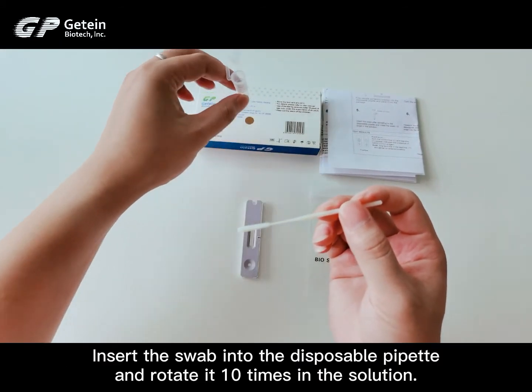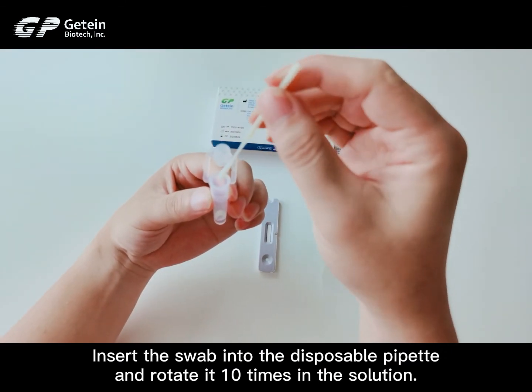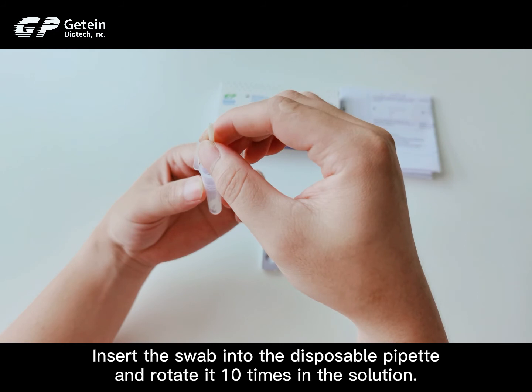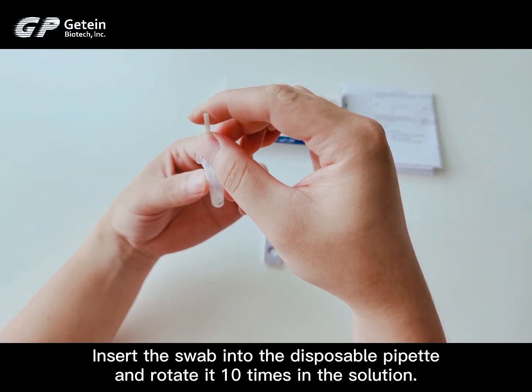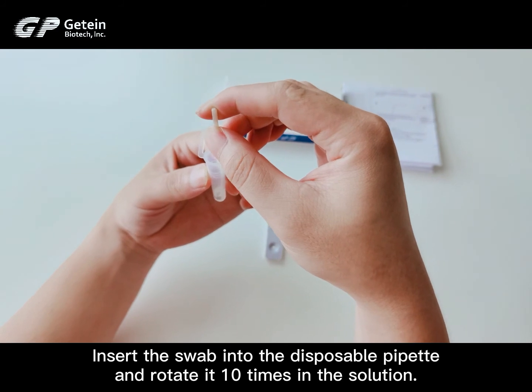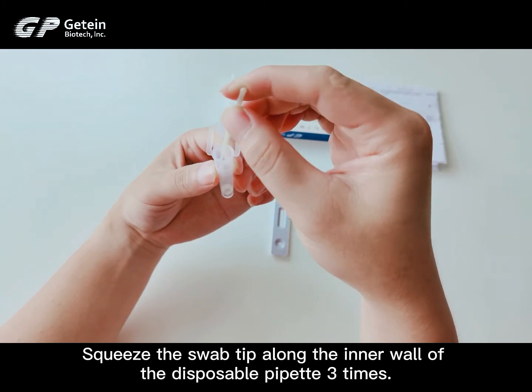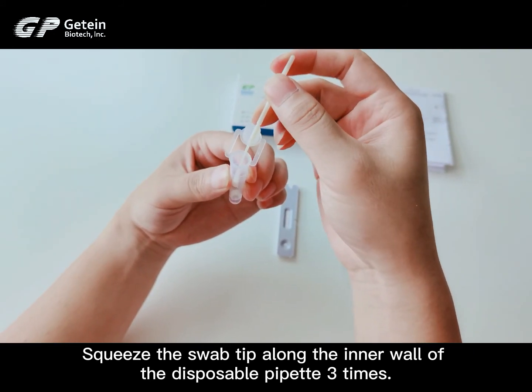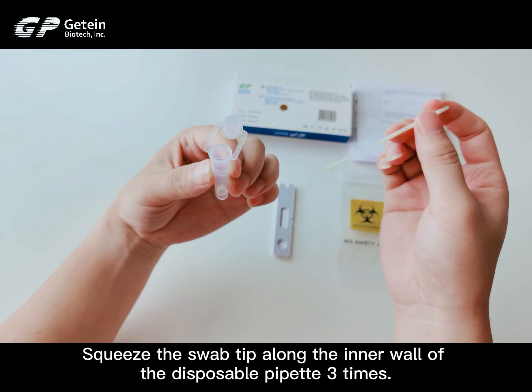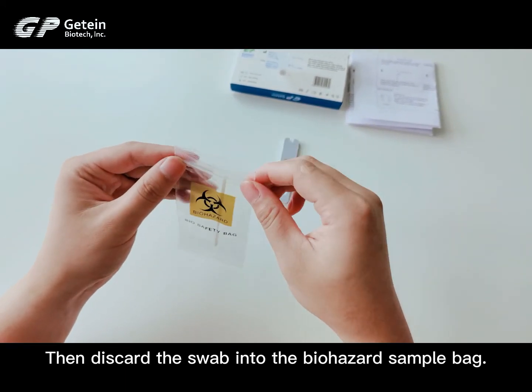Insert the swab into the disposable pipette and rotate it 10 times in the solution. Squeeze the swab tip along the inner wall of the disposable pipette 3 times. Then discard the swab into the biohazard sample bag.